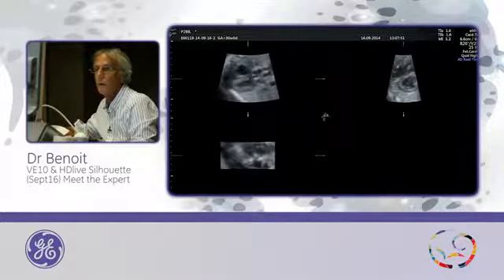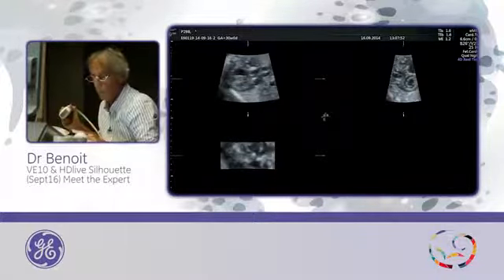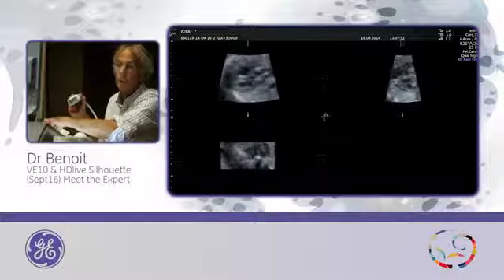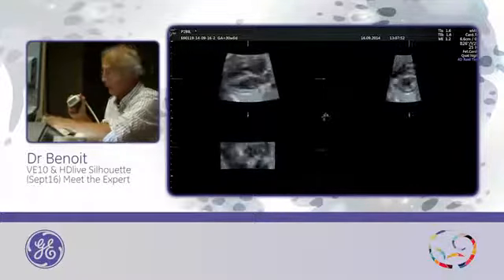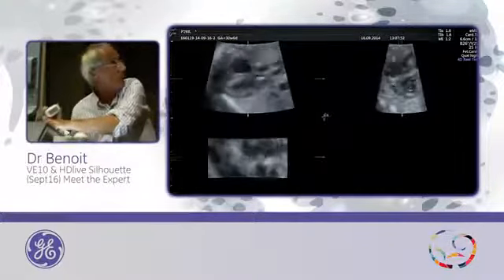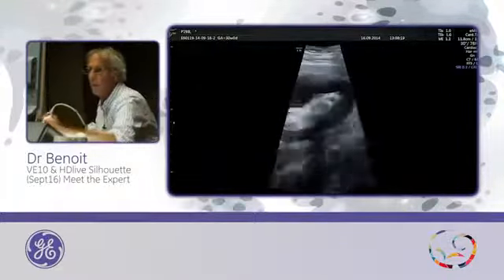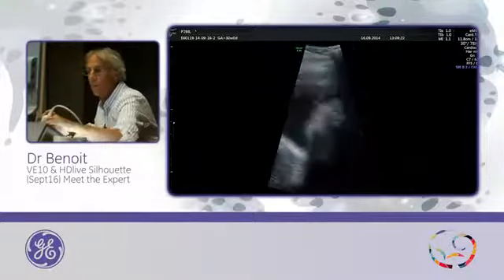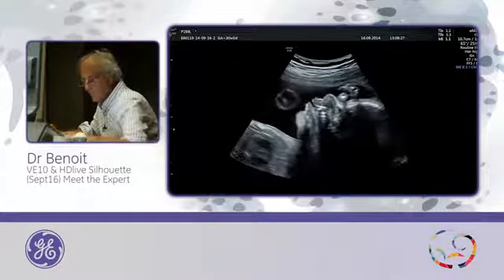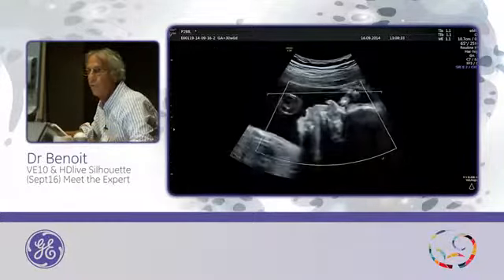Freeze. It's okay. And now within the heart, I will move. Start. And this is not a STIC, this is a 4D. That means it's really fast, and the quality, you can really work with this. I really like to use 4D.